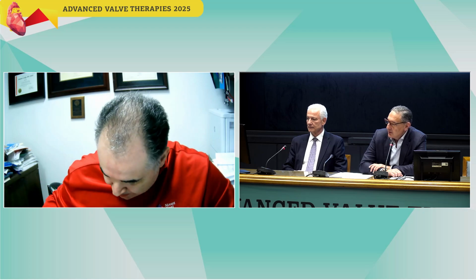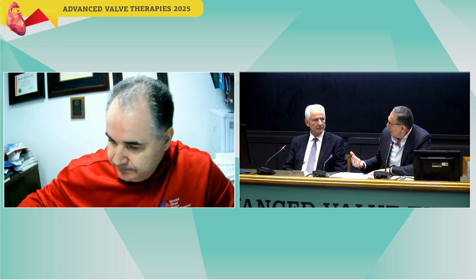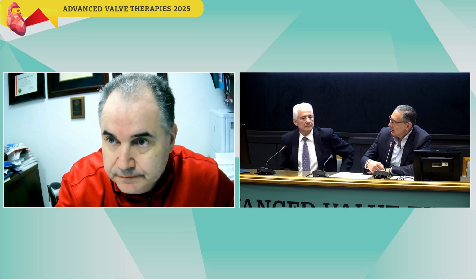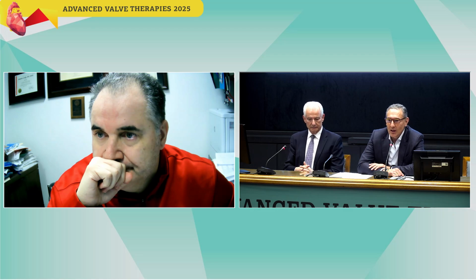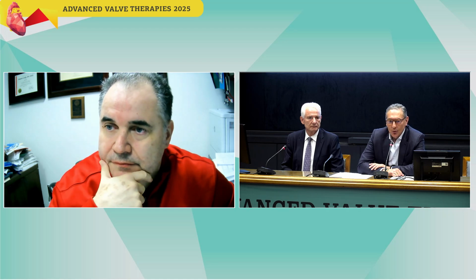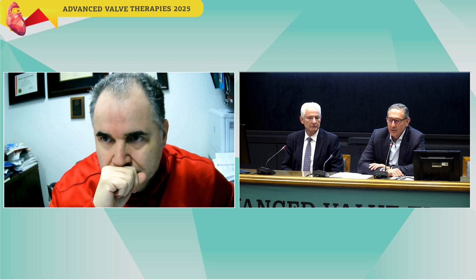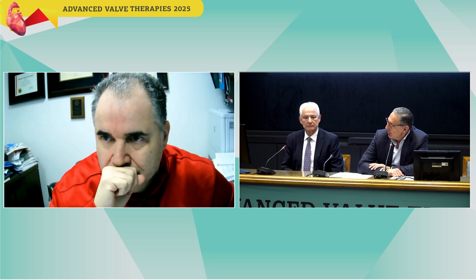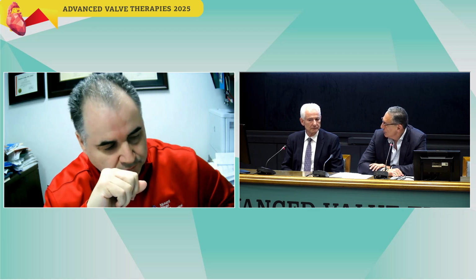Now, you'd be surprised to know that we heart surgeons, as much as our instruments and tools have evolved, still, in my view, make primitive decisions. Don't be shocked. What I mean is that imagine we open up the left atrium to replace the mitral valve, right? So our decision is two-dimensional. We use a primitive plastic tool to measure the dimensions, the void that is left behind after we remove the heart valve.